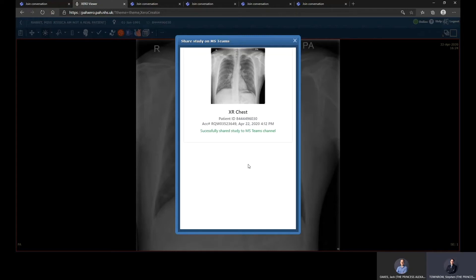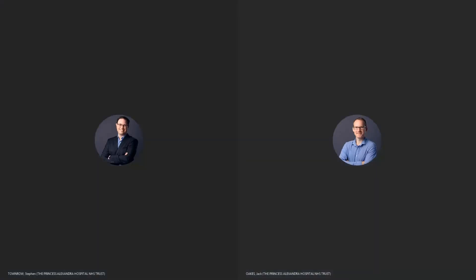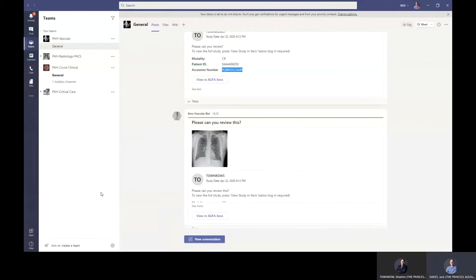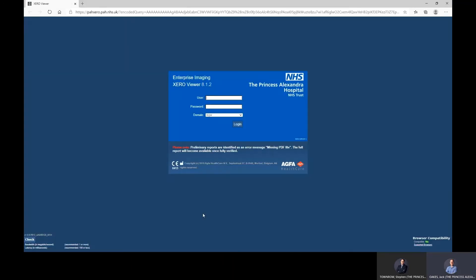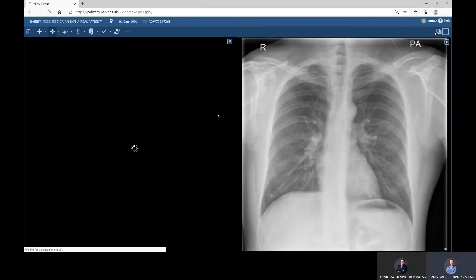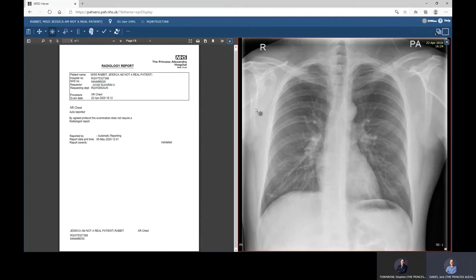I've got Jack who's signed in in another room. Jack, can you show your screen? This is the Teams interface where you can see the various teams set up in the trust, and you can also see the X-ray that Stephen has just shared. You simply click 'View and open in Xero', which will launch Xero Viewer. You log in here and this will bring you directly to the X-ray that's been shared. Additionally, this can be done on iPads and also on iPhone.